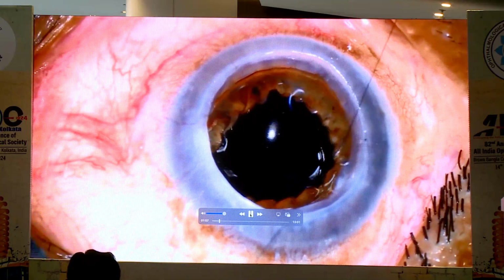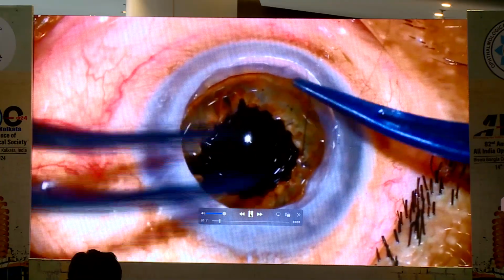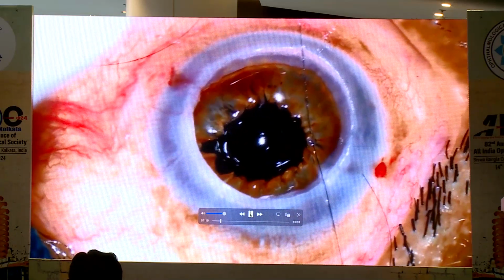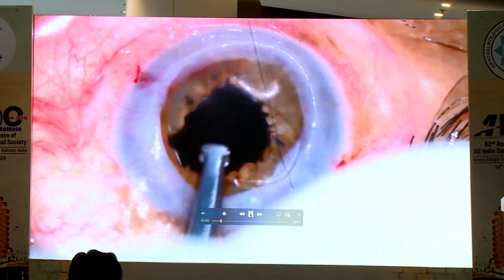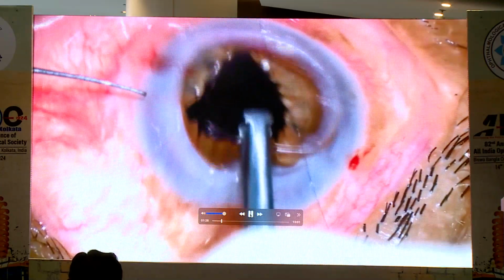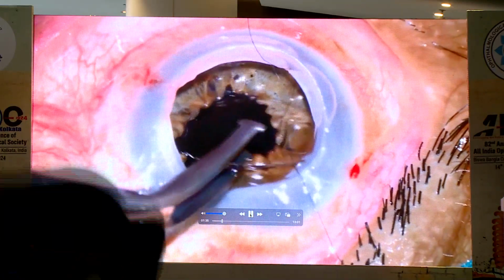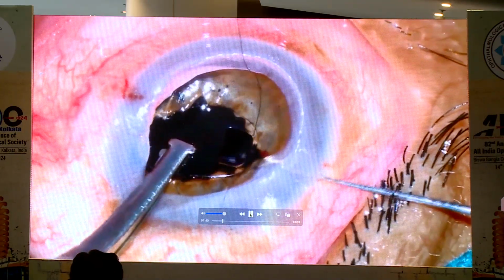After passing the Siepser technique pupilloplasty, just tighten it, and you will be able to constrict the pupil. Don't tighten it too much. Even in this situation you can see how it can be done. In this open sky condition, this is the only option. It is very difficult to perform scleral fixation with this type of lens. Even in this situation, you can see the retropupillary iris lens takes only a few minutes, about 1 minute. Within 1 minute, you will complete the procedure.